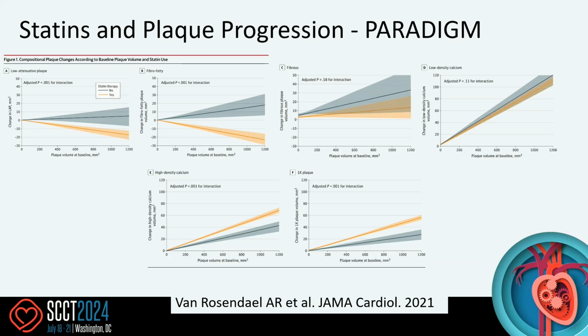The ultimate role, I think, of quantitative plaque imaging and characterization is our ability to discern what's happening to the plaque when you treat. And Alex is sitting there, with his great work in the PARADIGM trial, showing the need for quantitative plaque assessment to understand what happens to the plaque. Because when you treat a patient with statin and other medications as well, you decrease the amount of non-calcified plaque with low attenuation, fibrofatty plaque, and you increase the calcified plaque. So you fundamentally change the composition. And unless you have quantitative characterization of those features, you will not be able to understand these changes over time.